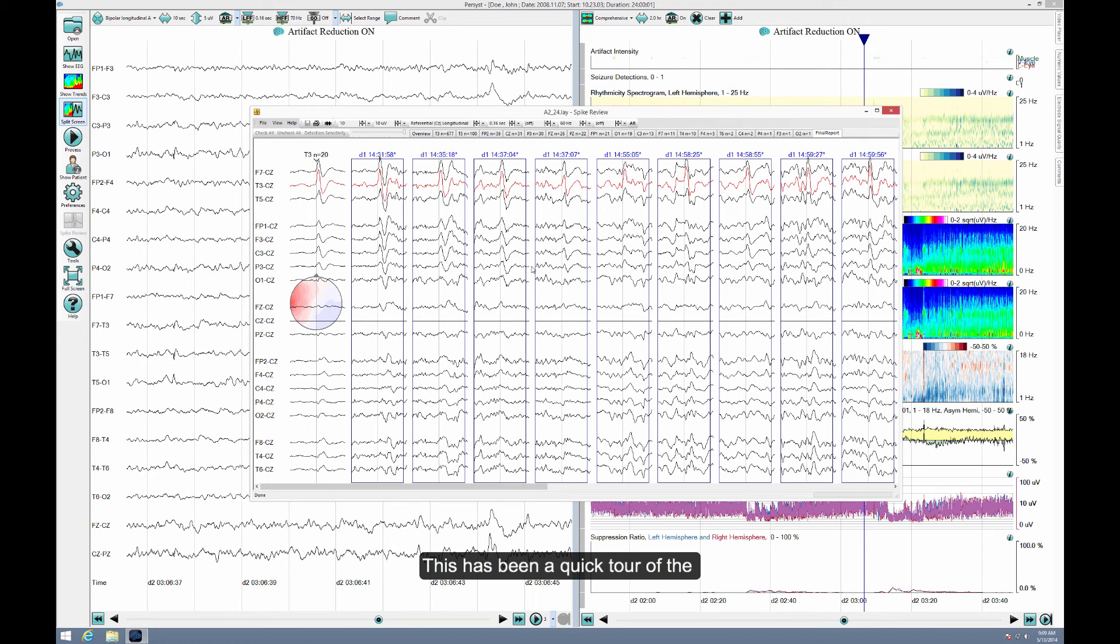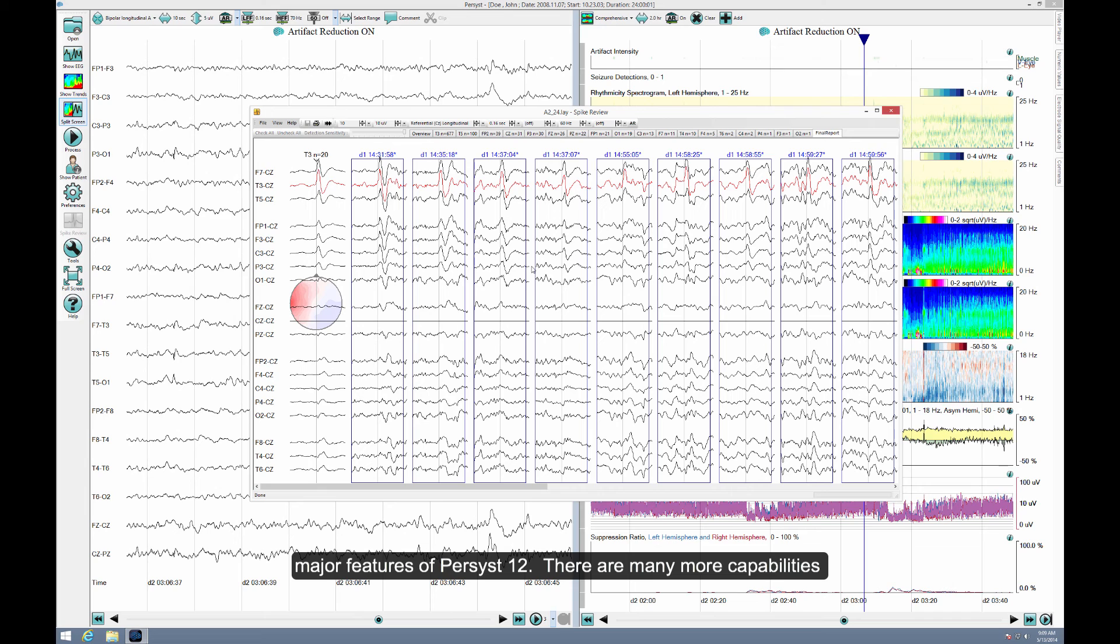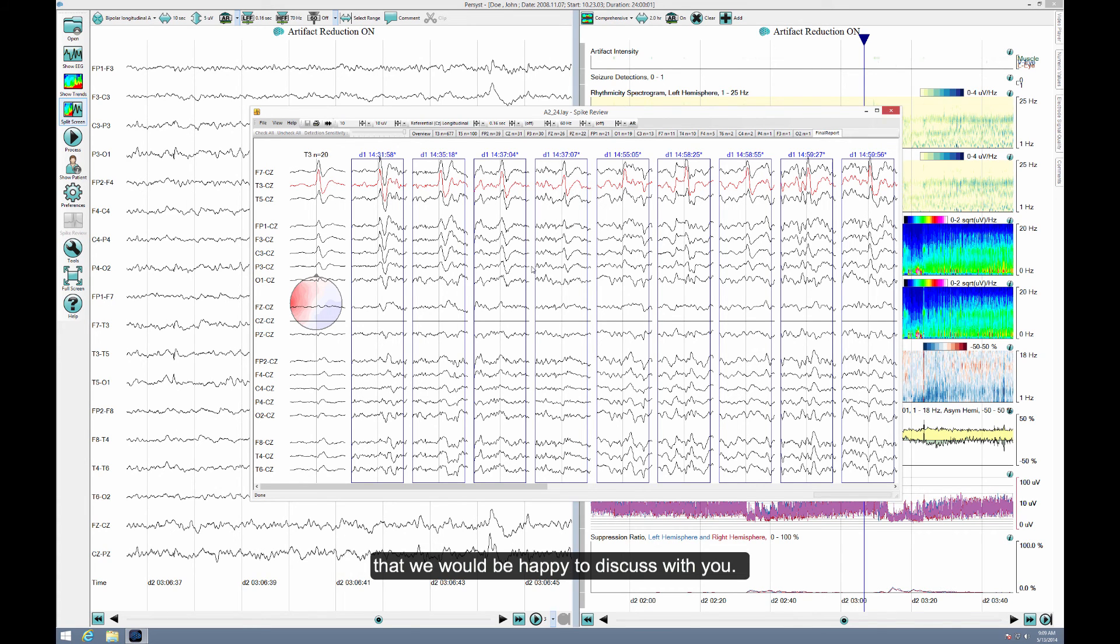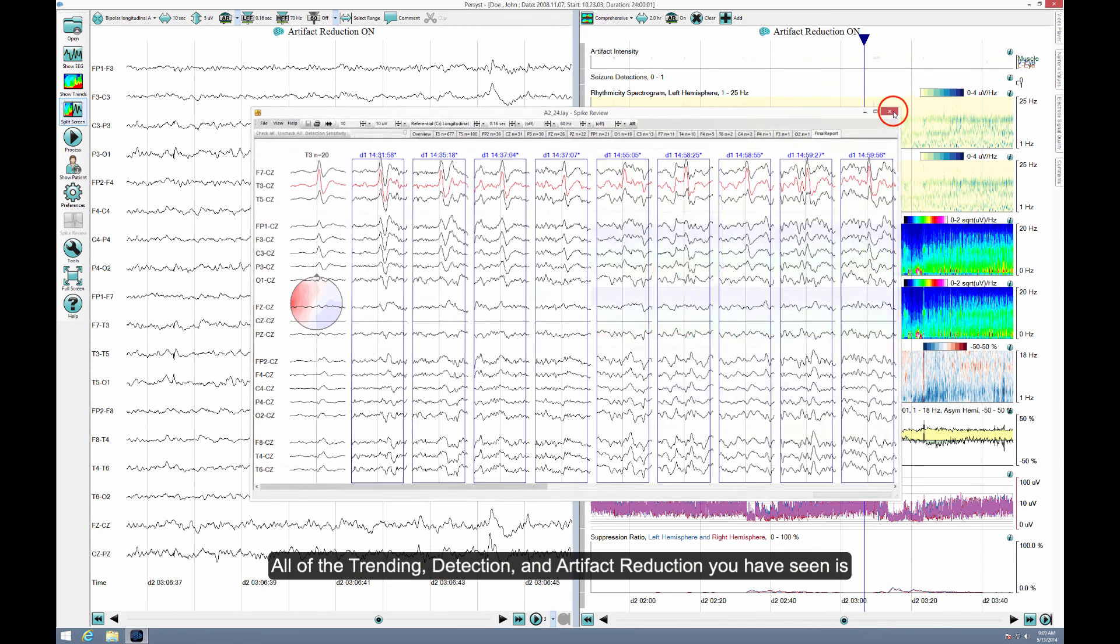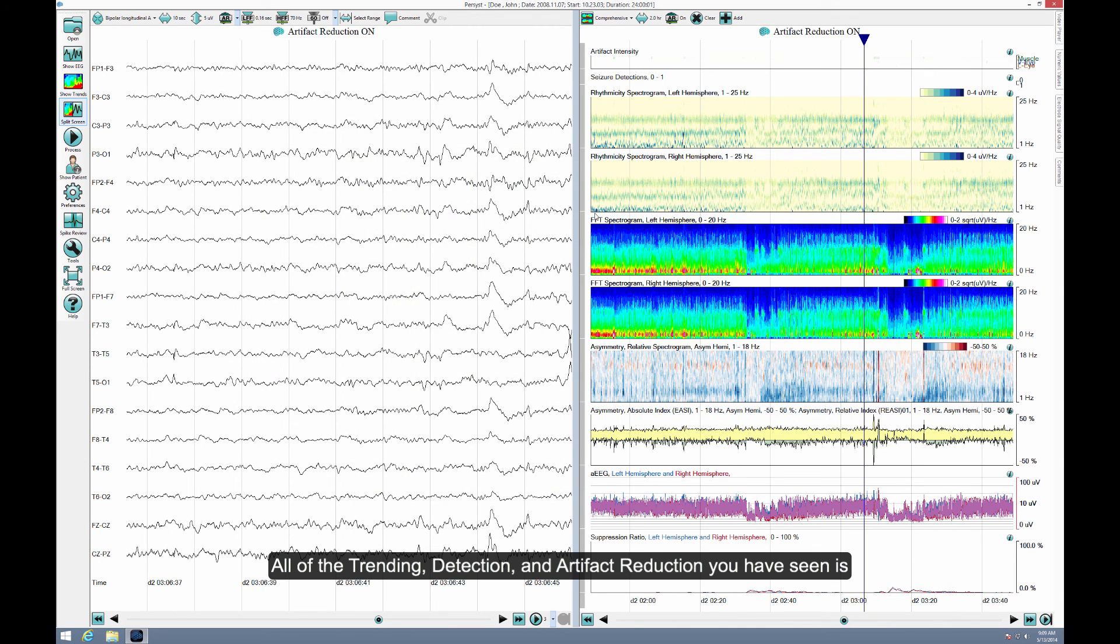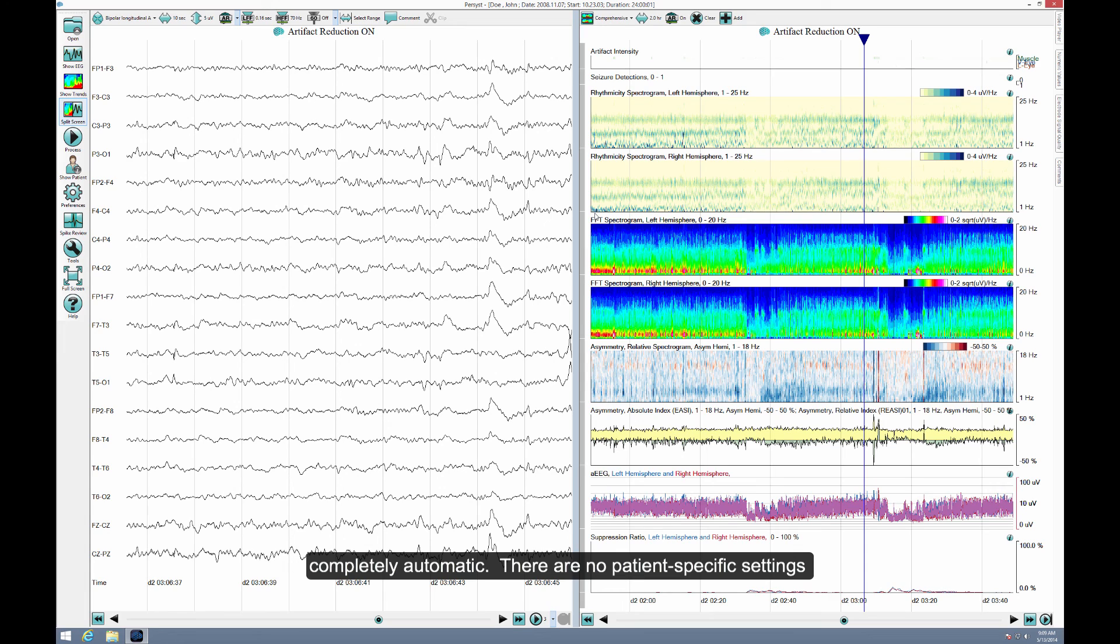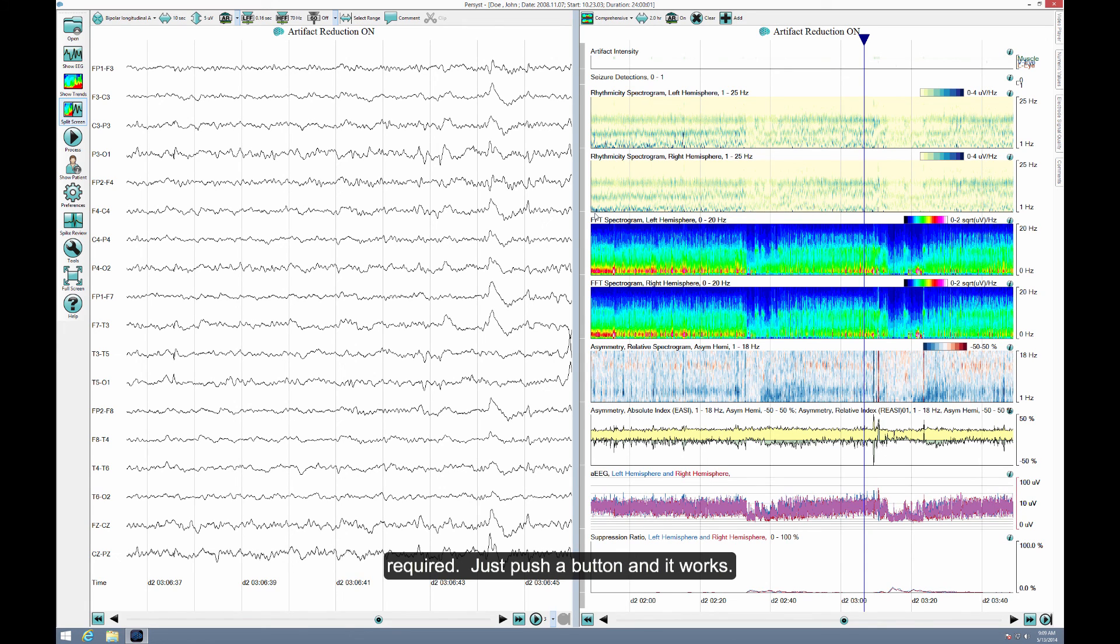This has been a quick tour of the major features of Persyst 12. There are many more capabilities that we would be happy to discuss with you. All of the trending, detection, and artifact reduction you have seen is completely automatic. There are no patient-specific settings required. Just push a button and it works.